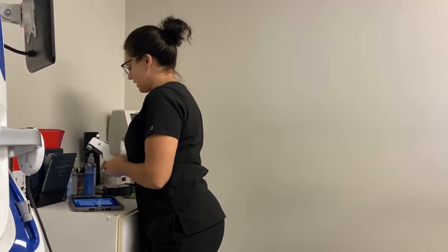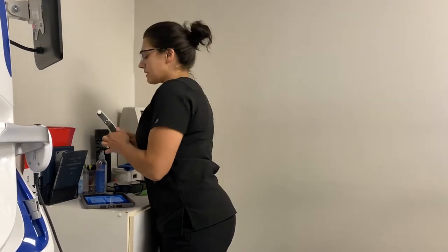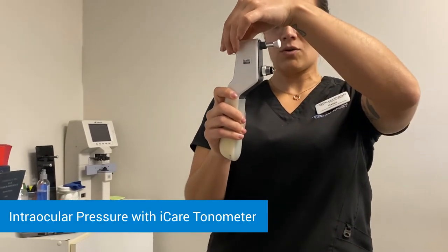Next we're going to grab your eye pressures here with the iCare tonometer. The top part is going to rest above your brow, the bottom part is going to come up to your eye. You may feel a little flutter — just try not to strain or hold your breath.